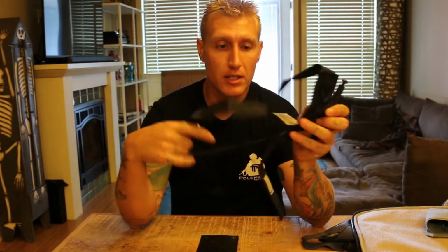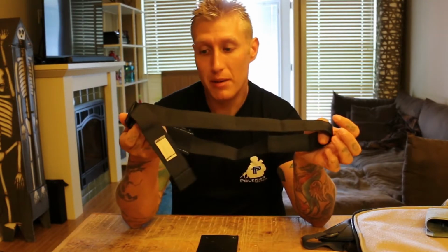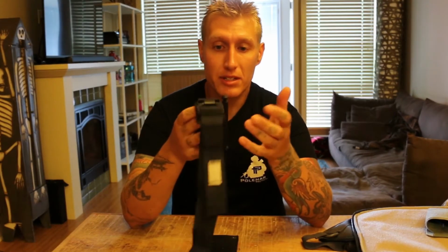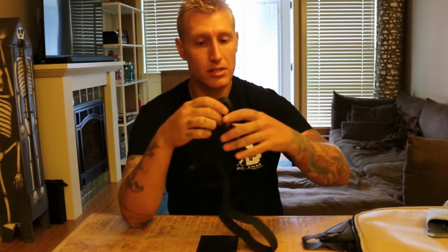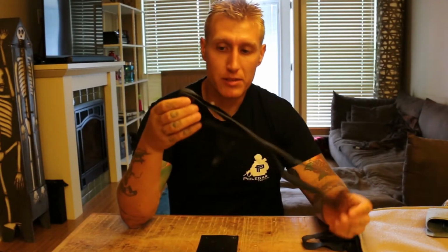So this is the soft T wide tourniquet. Make sure when you're going to use this for the first time that everything is in place, that there's no rips, tears, cuts, that it hasn't been damaged by the weather or anything like that, that it's basically in really good serviceable condition. So the first thing I'm going to do is adjust this webbing here so that it's the proper length for me to work with for doing this method.